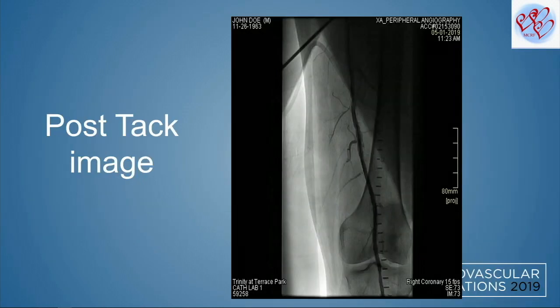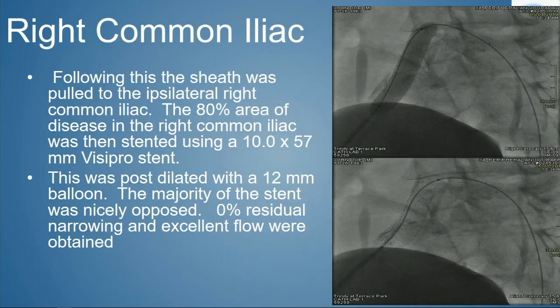This is a post-TACK image at the FEM-POP segment. It's hard to appreciate the tacks on angio. It's very minimal stents, very minimal scaffolds that it's made of.